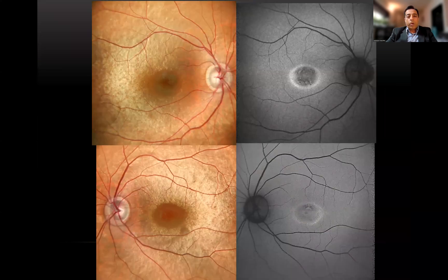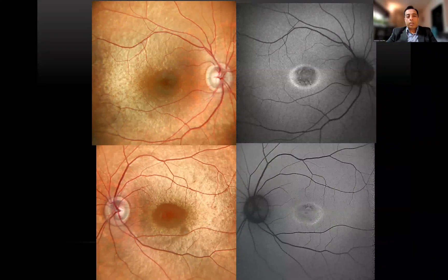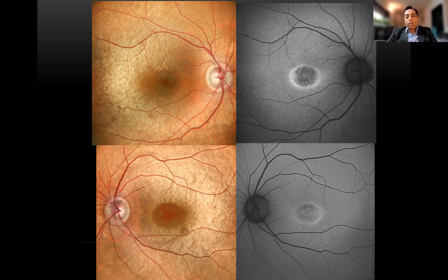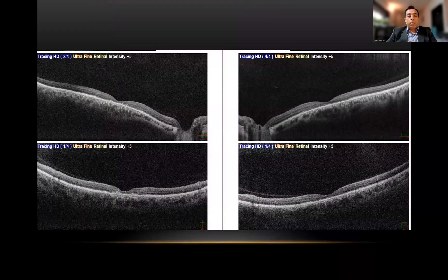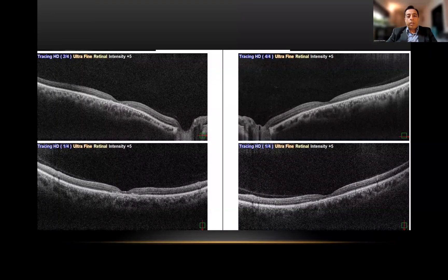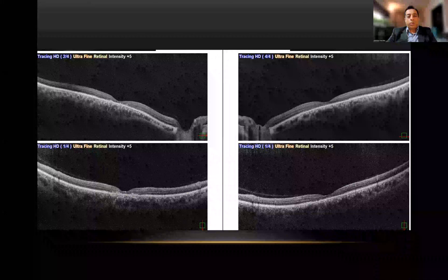When you do the autofluorescence, you can make out that there is a bullseye-like phenomenon — there's a dystrophy probably there. With the Mirante color photographs, you could instantly make out what is much more difficult with regular fundus cameras. The OCT of the same patient confirms the thinning of the fovea.